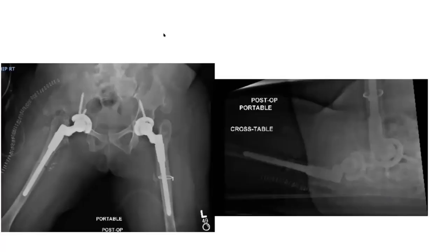All right, on the right-hand side, it looks like a diaphyseal fitting modular stem, uncemented. It looks like there's a modular shaft body and a different modular neck as well. Right. So where's the fixation mostly? Actually, metaphyseal, huh? Yeah, exactly. So that's the one we were talking about. And I'll show you the pre-ops.